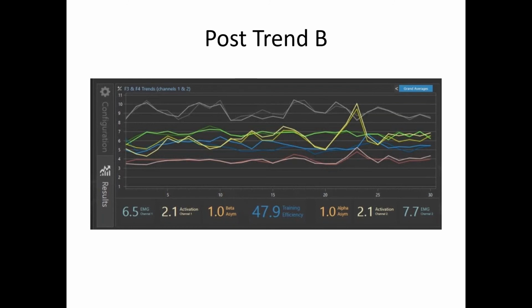And so as we get to the top of the hour, that's what we're looking for in the trend screen. That's the full rationale of it. And we even threw a little bit of quantum physics and functional biology, thanks to Martin, and a little bit of bad actors in the EEG from Rob, and then we got whack-a-mole from Michael, which was really a good way to put it.